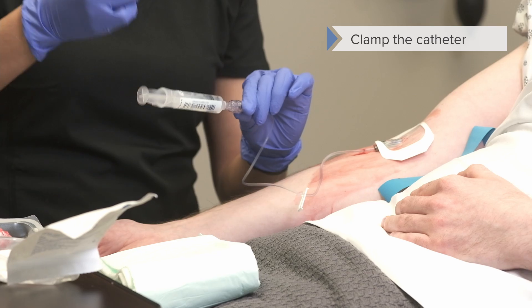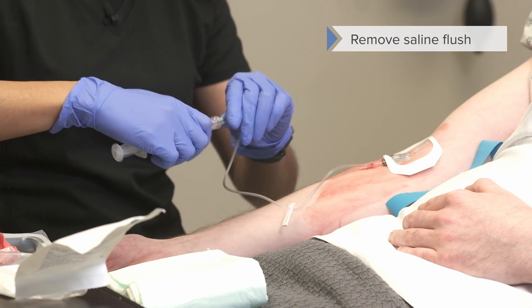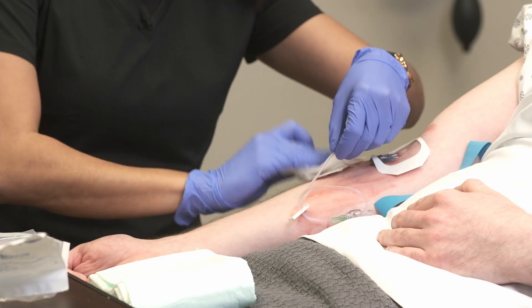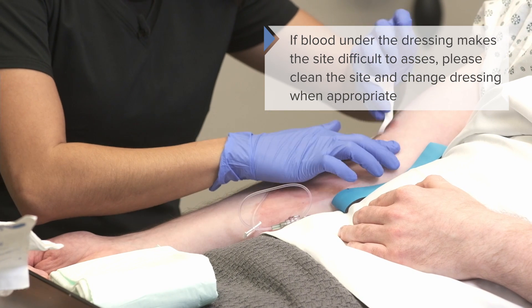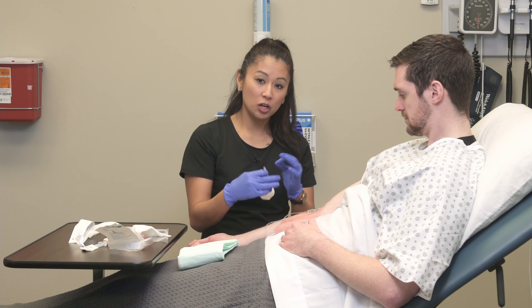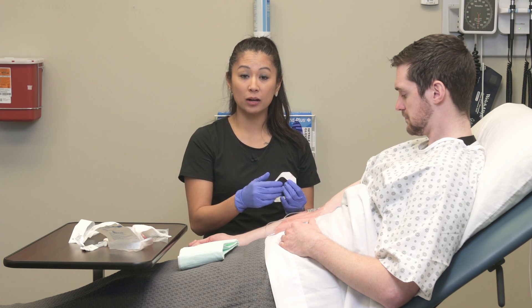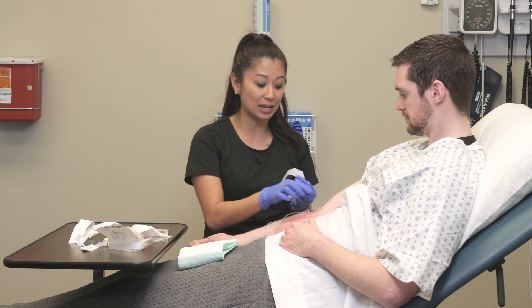Now I'm going to clamp this. You'll notice why I kept the plunger attached — that way I'm not trying to finagle it later when I'm trying to hold pressure. Now, there's a difference from facility to facility: some facilities put a stabilization device underneath the transparent dressing. However, many facilities do not allow tape underneath the transparent dressing because that's another microbe attractor that could get under there.